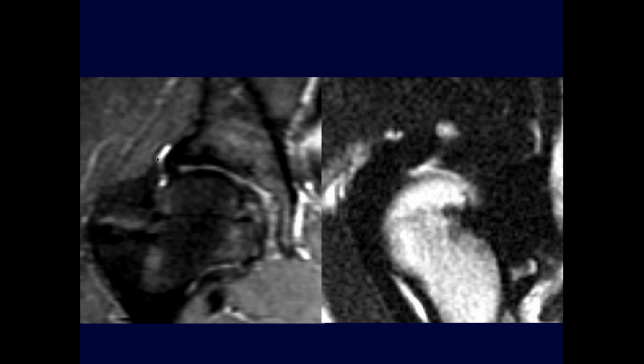I think there's a paralabral cyst extending superiorly there, so I would say that there's probably a non-visualized tear. You're right there, okay. Yeah, so you can see why in the early days, people pressed to get arthrography when they did hips, because it was hard with the technology we had to get the right coils in order to be able to do high-resolution local coil imaging.